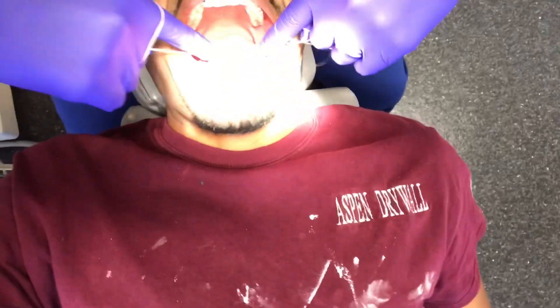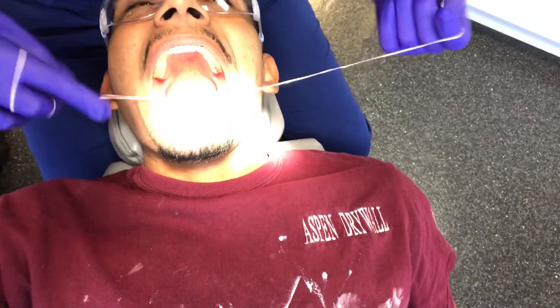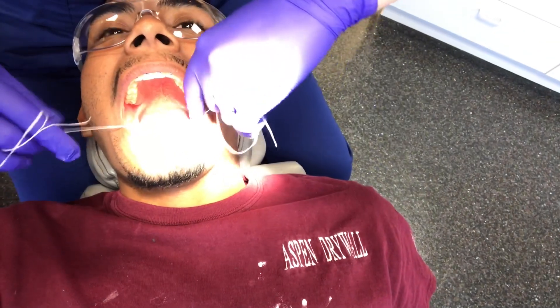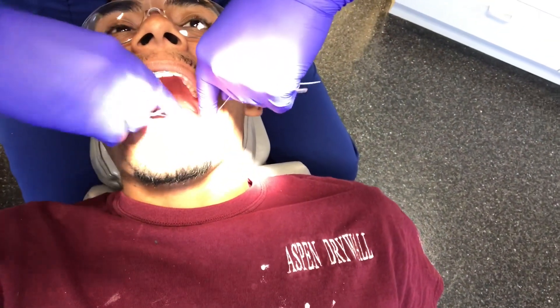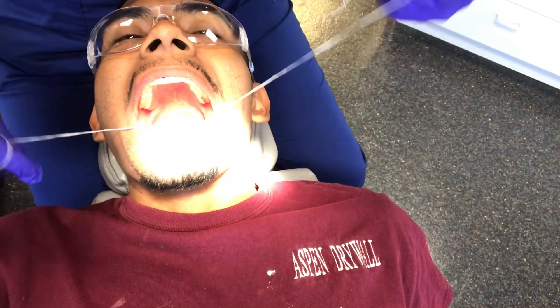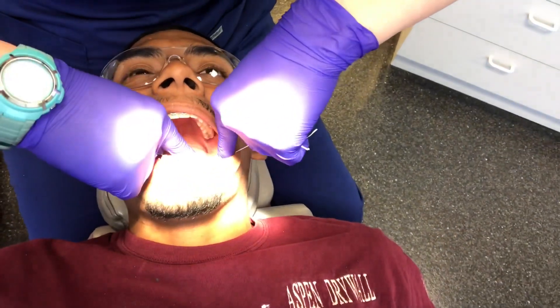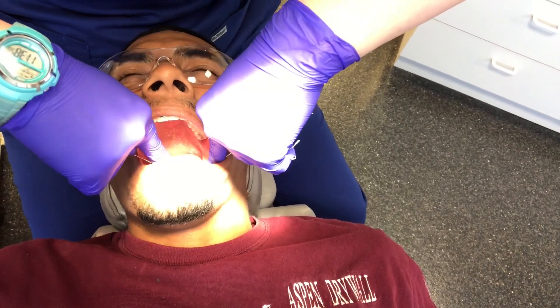So I'm just going to floss your teeth like normal. You and my friend have very tight connections. You do have a filling that's kind of right there, so that makes it a little tighter. I will let you know you're going to feel pressure. All right, here's that pressure.